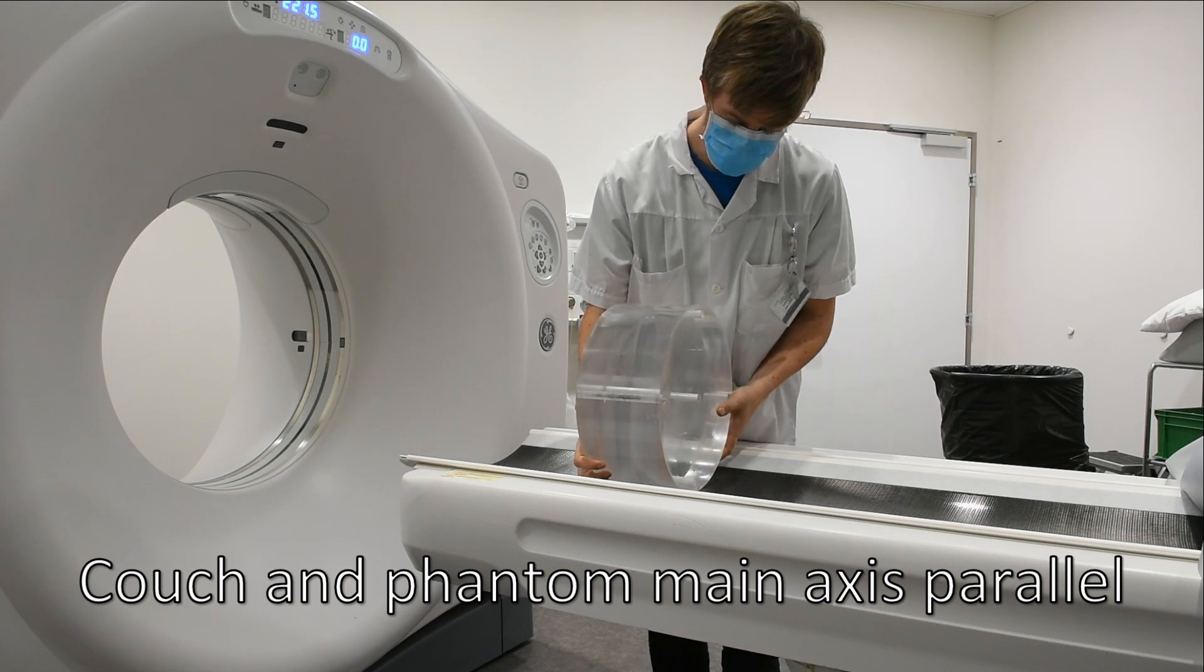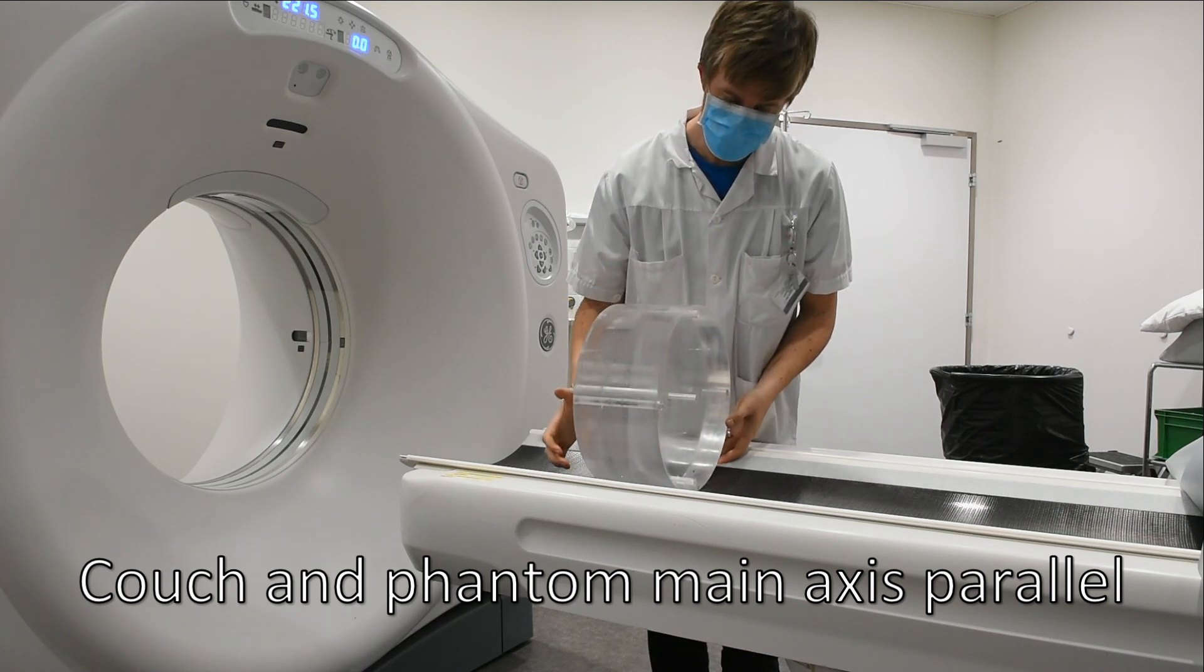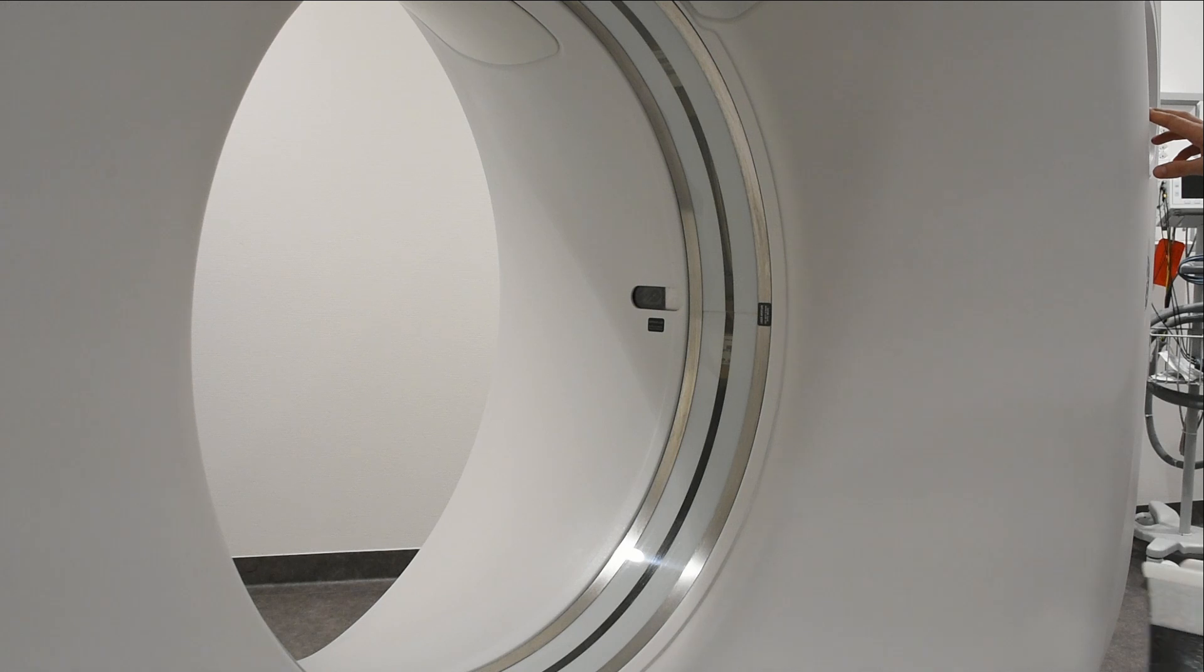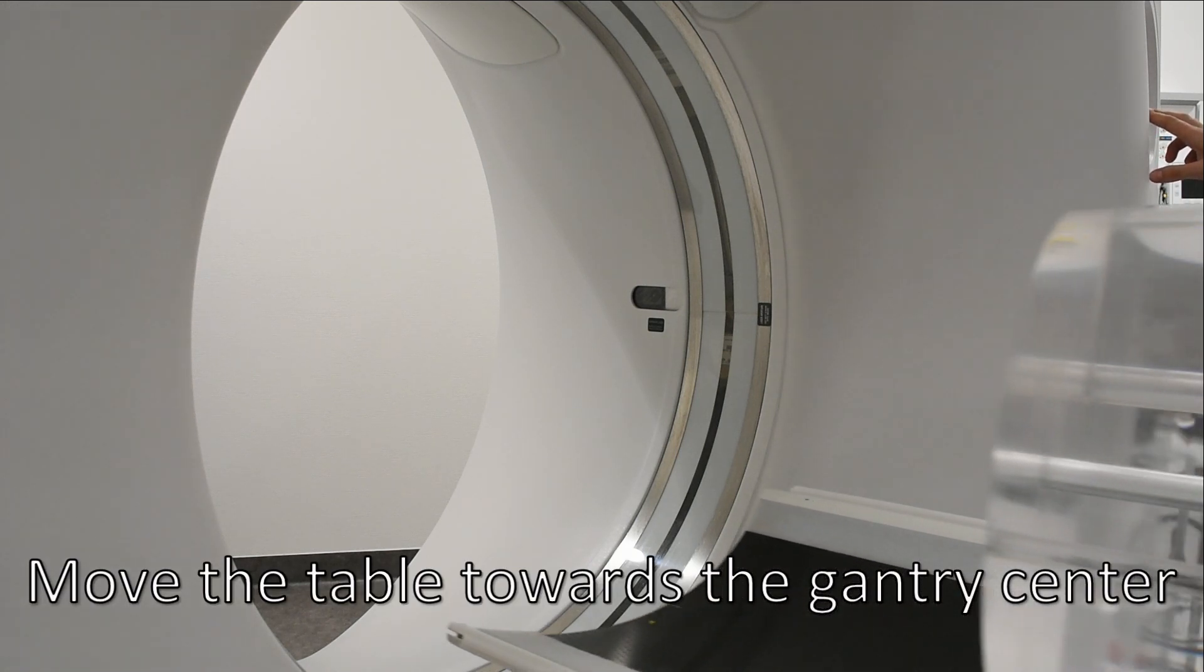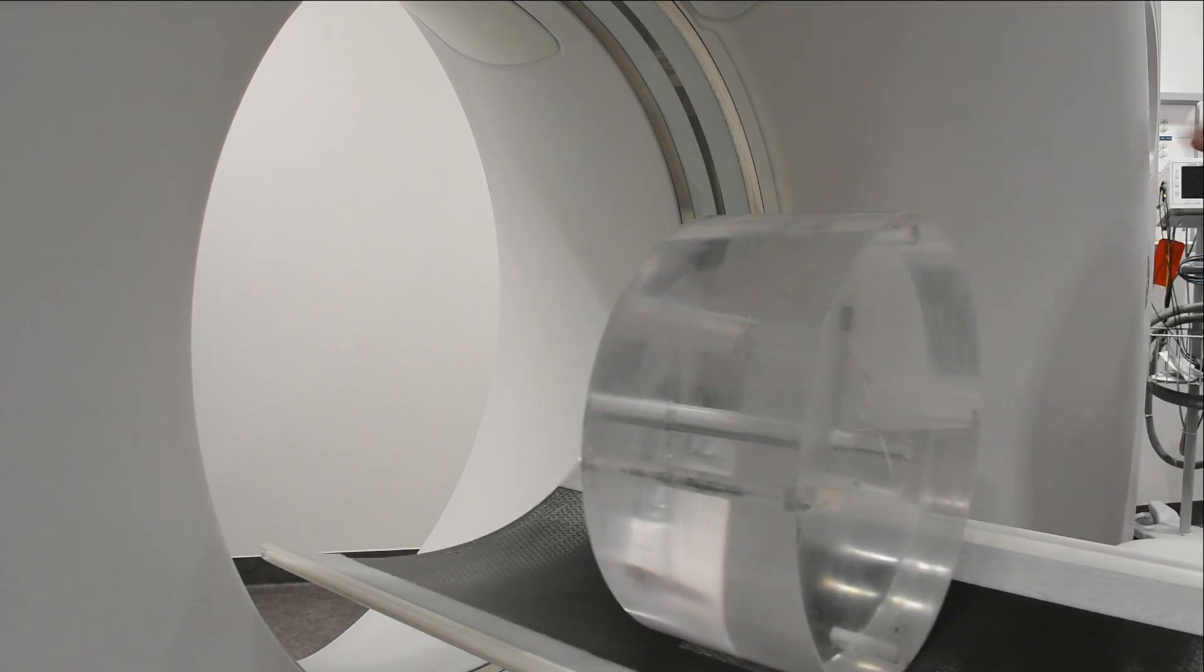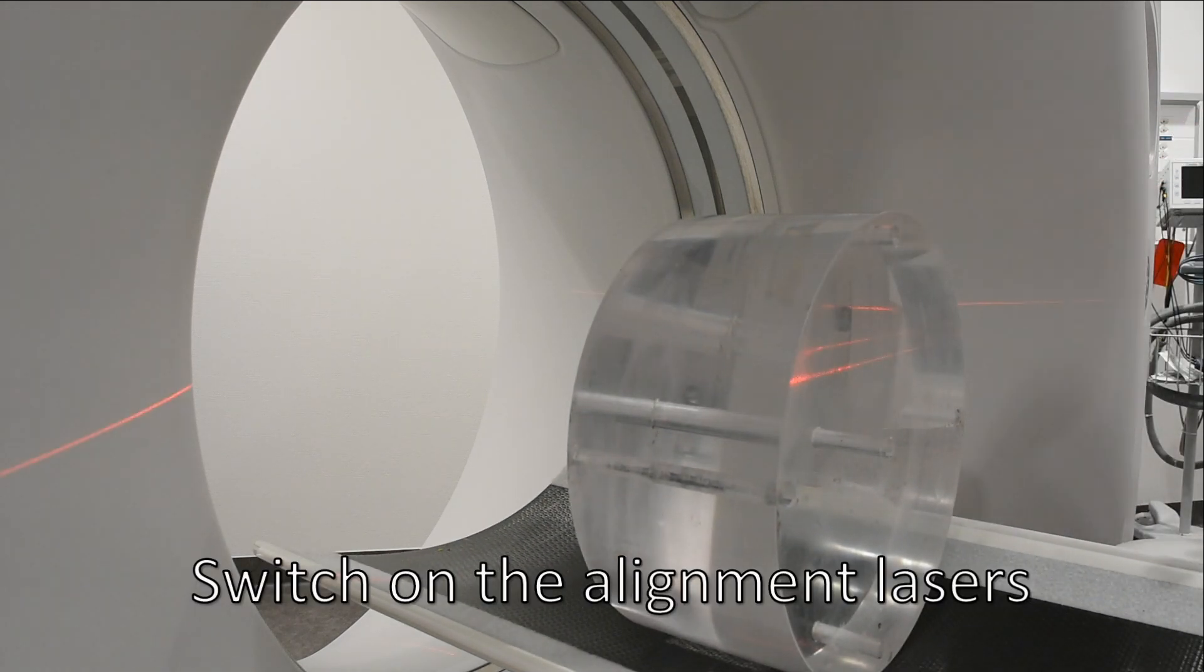Make sure the couch and phantom main axis are parallel. Move the table towards the gantry center. Switch on the alignment lasers.